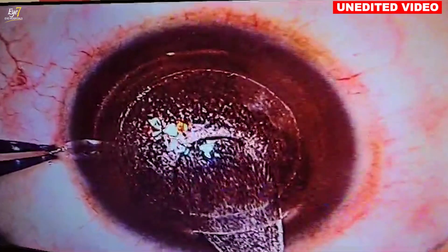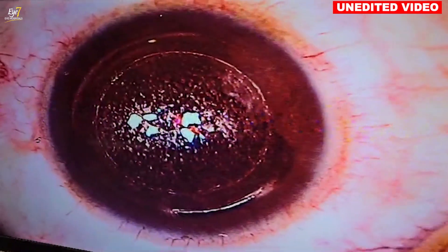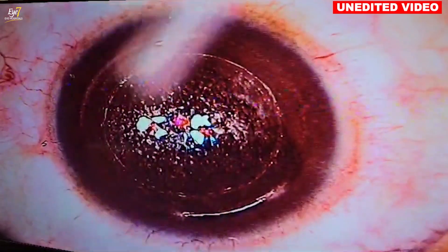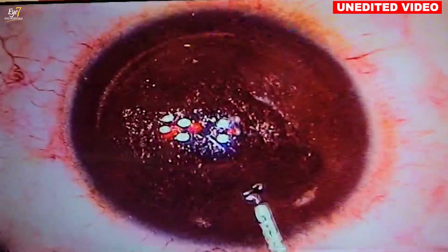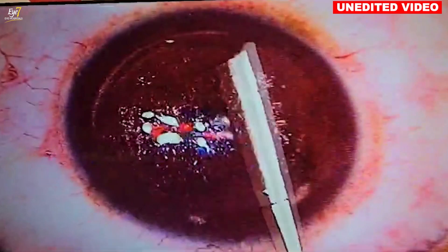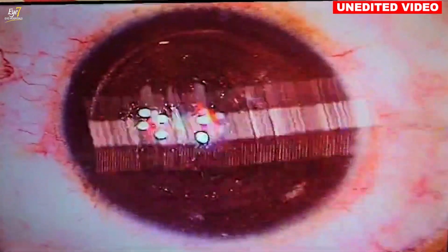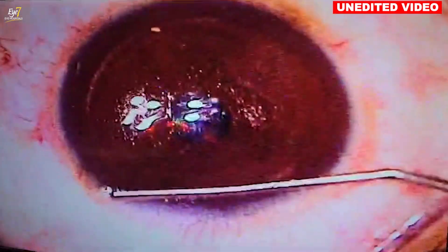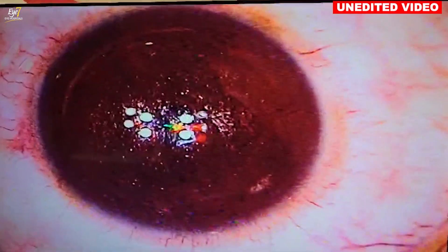For the initial 50 to 100 cases I recommend checking the lenticule, but with experience you get to know that if there was a difficult dissection then you check it — otherwise you can just proceed. I have the habit of cleaning the interface properly so there is no debris or lint inside. Then this is the most important part, called ironing — just to make sure there are no folds. And then soft ironing.